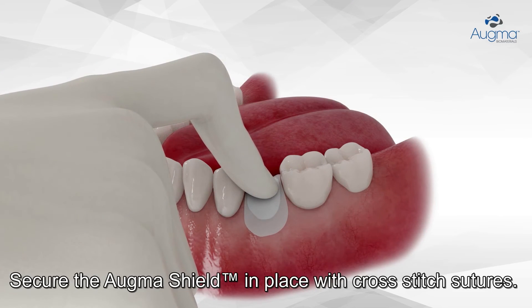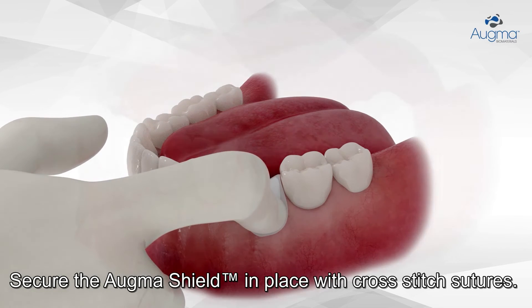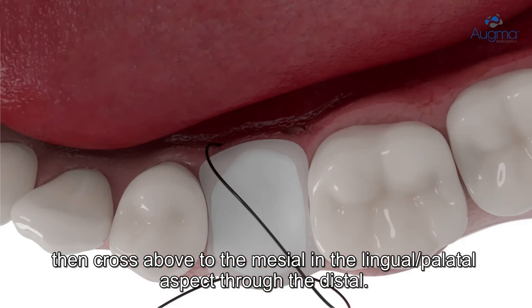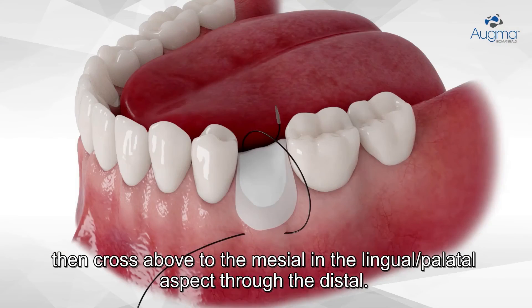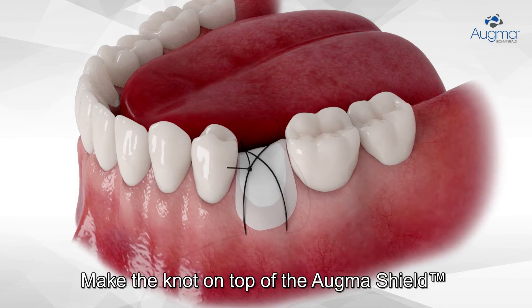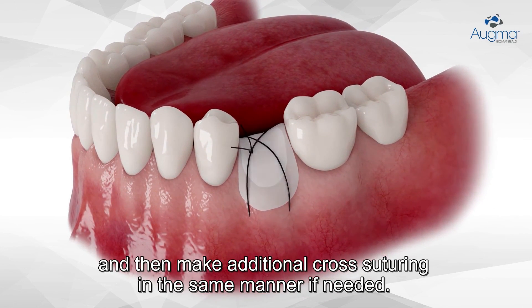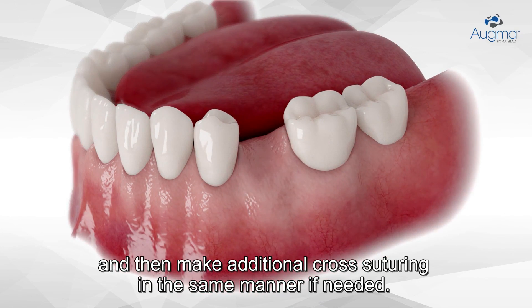Secure the Ogma Shield in place with cross-stitch sutures. Start suturing from mesial to distal in the buccal aspect below the Ogma Shield. Then cross above the mesial in the lingual-palatal aspect through the distal. Make the knot on top of the Ogma Shield and then make additional cross-suturing in the same manner if needed.